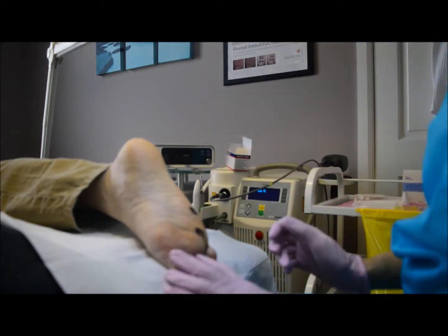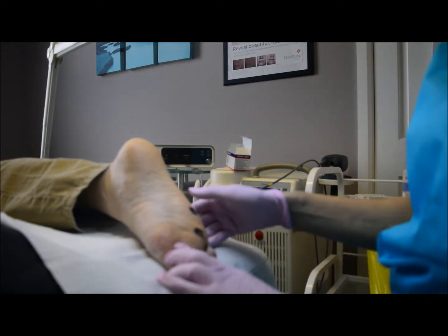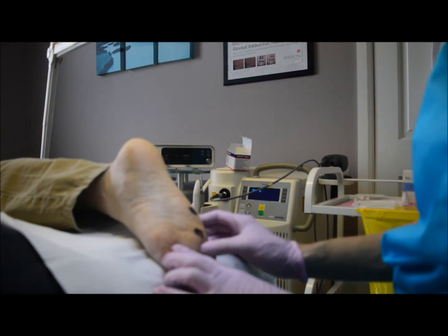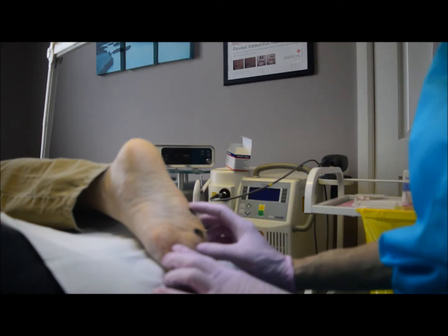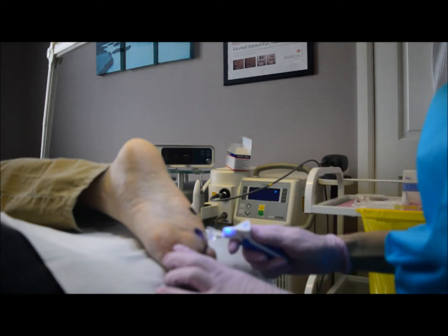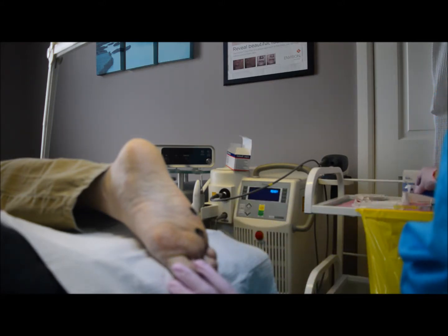Both the Swift and the laser are uncomfortable procedures, and often when we're using both without any analgesia we can't get enough energy to effectively treat the verrucas. You can see these are two areas here that I've previously treated with the laser, and on both of them I've used this little vibrating device to successfully get analgesia in so I can anesthetize.